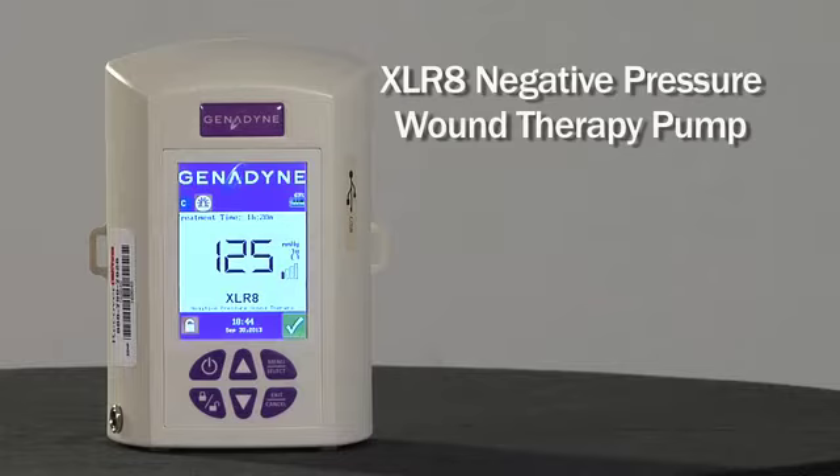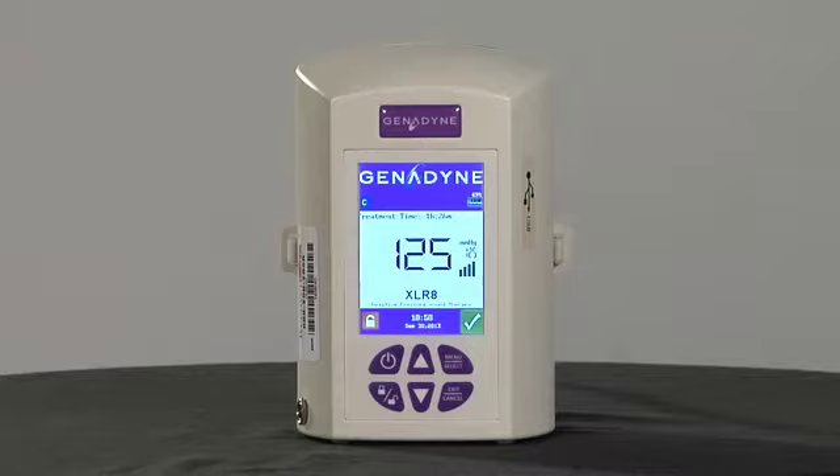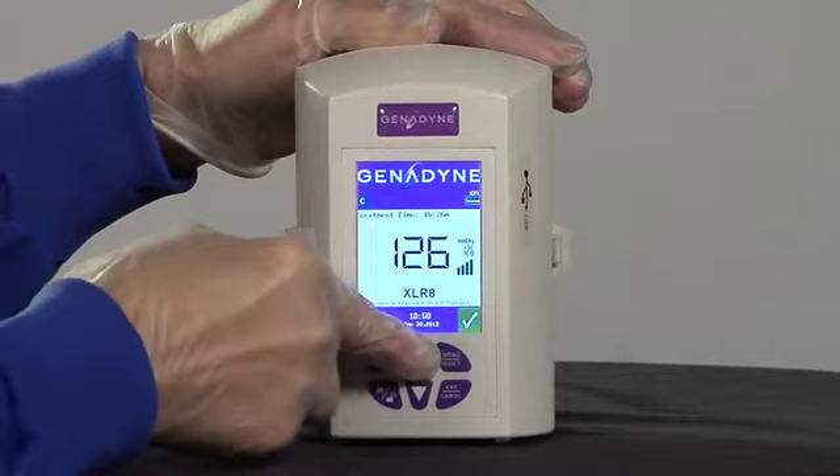Welcome to the educational program on the Accelerate Negative Pressure Wound Therapy Pump. The Accelerate Pump is indicated for use on patients with acute, chronic, partial thickness or full thickness wounds. The Accelerate provides advanced technology using the industry standard negative 125 millimeters of mercury, but may be adjusted in increments of 1 millimeter to meet specific prescribing physician's order.